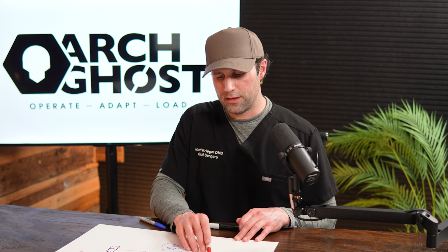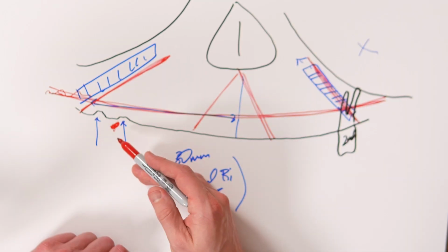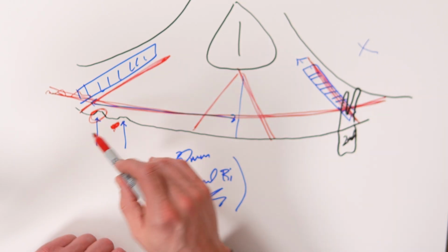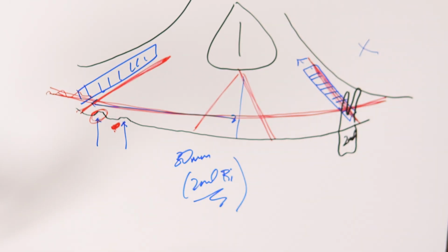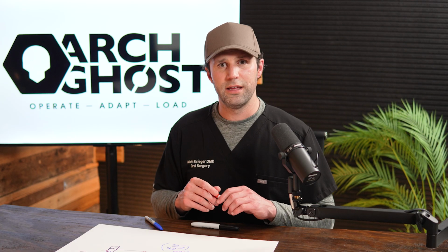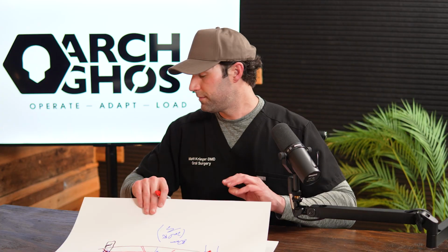And this is what I see a lot of surgeons do, even experienced surgeons. They do the reduction before they mark their line. And then they come back and say, well, now I don't know where I should go. And that's why they put a hole in the sinus or use a guide or other things when the guide was right here. It was right here to start with, but you removed the guide before you used it. So use the guide first, mark your line, and then do your reduction. And that will be the game changer for you. So socket or a defect is highly advantageous and is the lowest hanging fruit out there that you can use. All right, that was number 2.